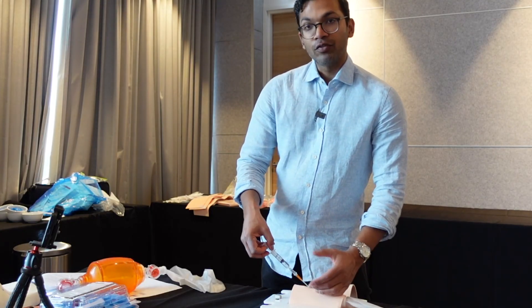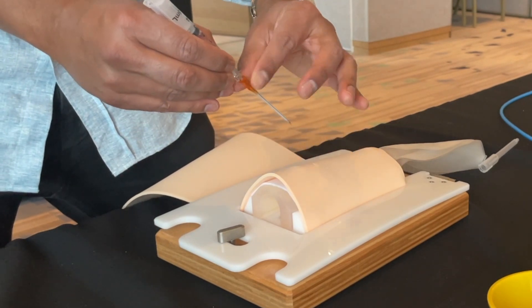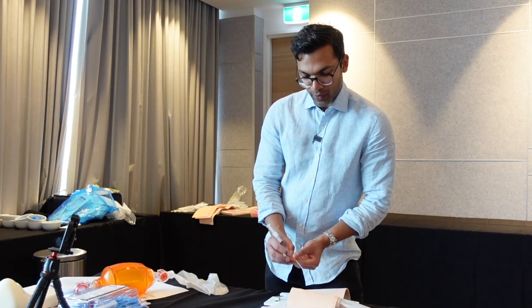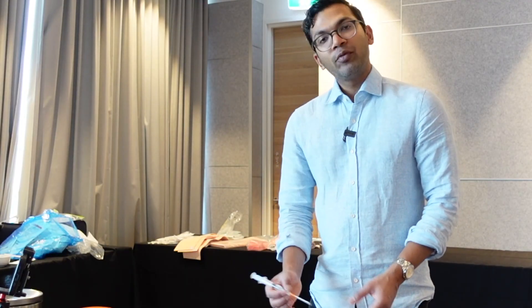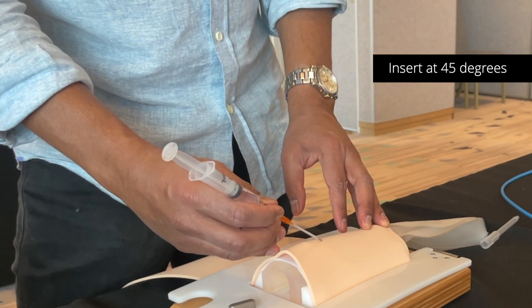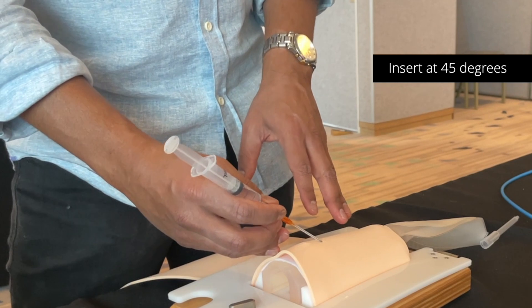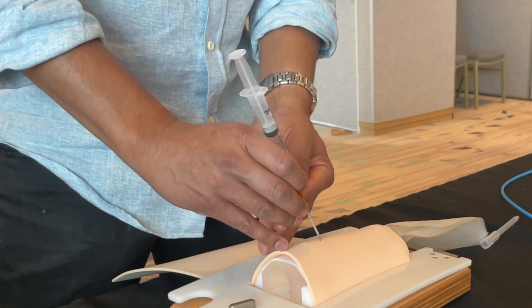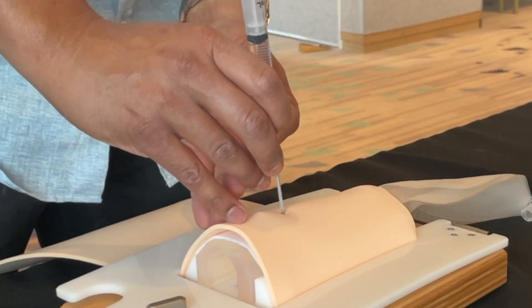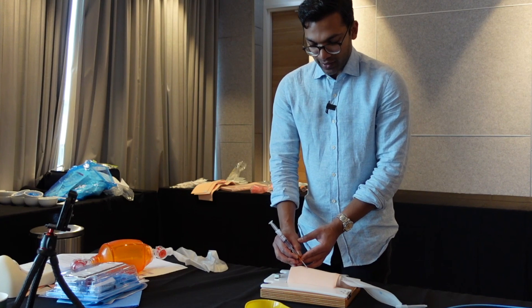If you're unsuccessful on your first attempt, remove both devices together so they stay joined prior to getting the first aspiration of air. In a standard neck, be careful about the angle of insertion. We say 45 degrees because that way you get a nice trajectory of a few centimeters into the tracheal wall. A vertical insertion gives you less distance than a 45 degree angle, so an angled insertion is better.